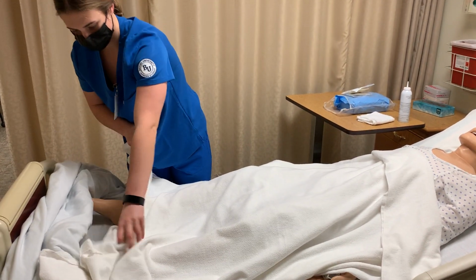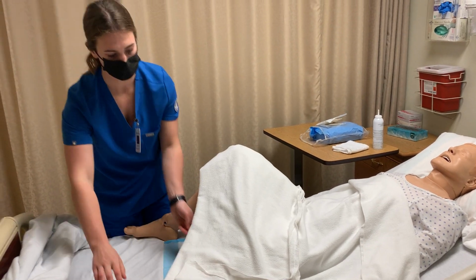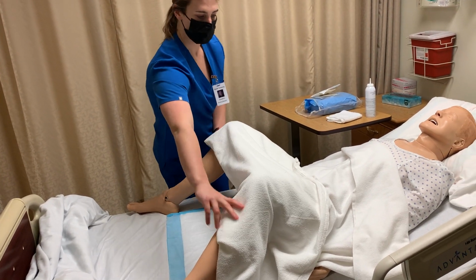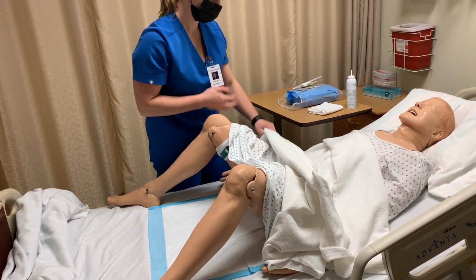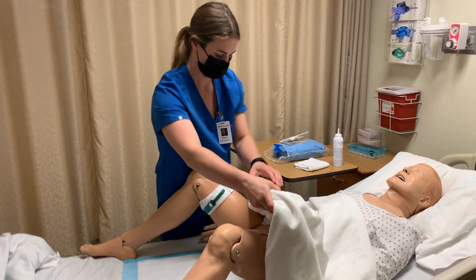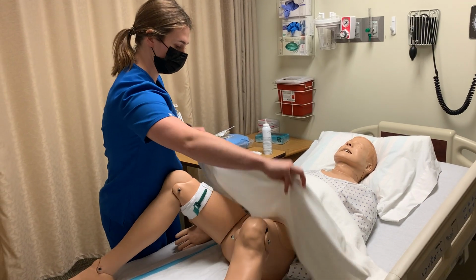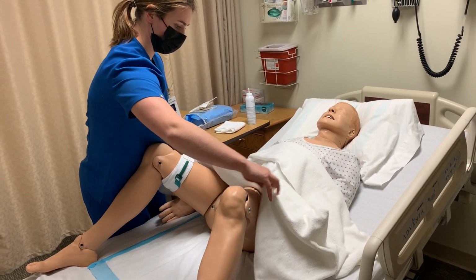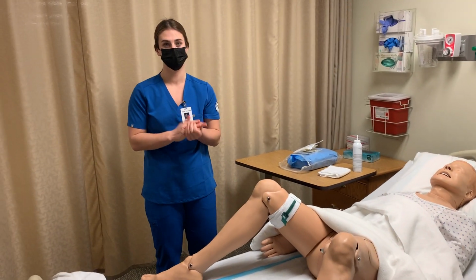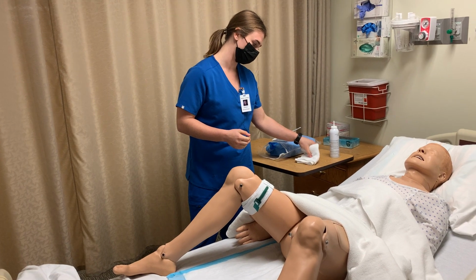All right, Alexa, you can go ahead and bend your knees up and spread your legs out to the sides of the bed. Okay. I'm gonna pull your gown down. Okay. So at this point in time, I would don some gloves, and we would perform pericare just to make sure that the area is nice and clean.